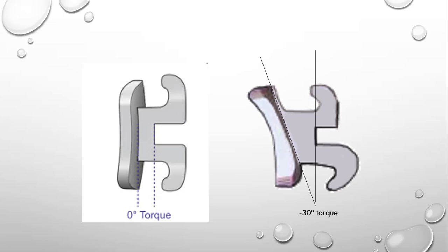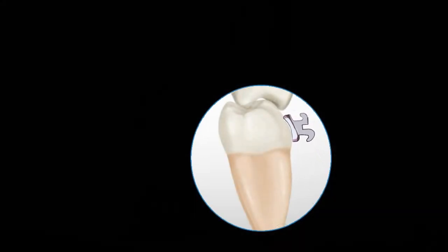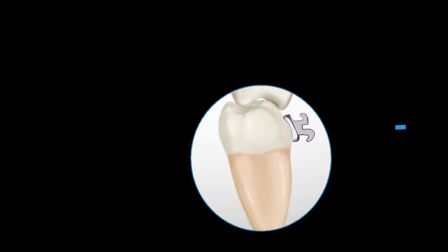now you will appreciate that heavy rectangular wire will go straight into the slot without applying any kind of unwanted force. In this way, the wire can go straight without any need of third order bends.